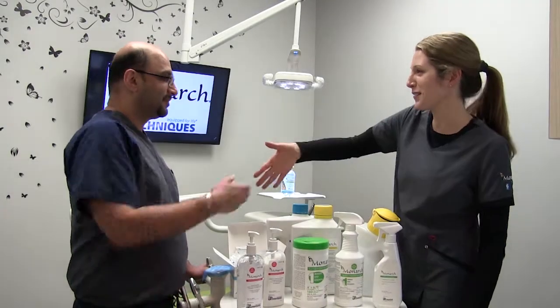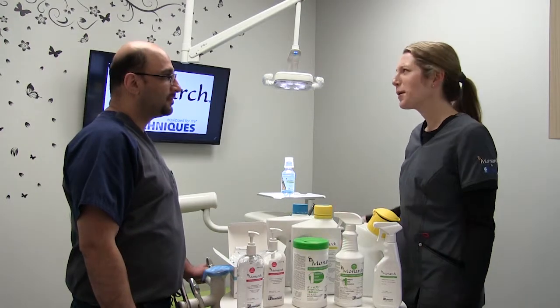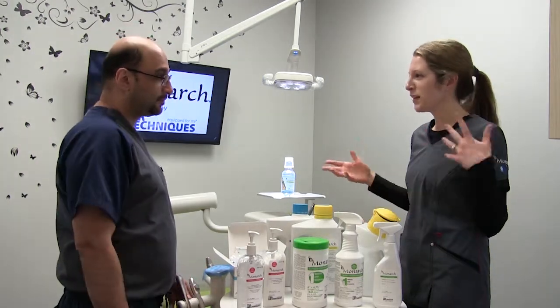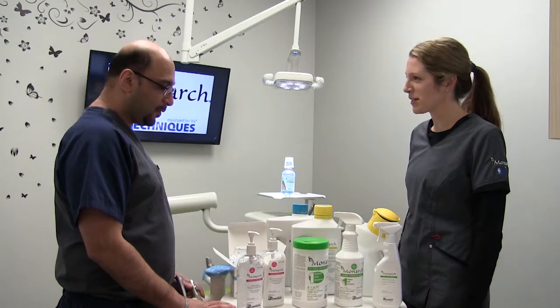Hi Dr. Rasek. I'm Carly Fish with Air Techniques Monarch. Thank you so much for having me in. Beautiful practice. I'm here to go over the Monarch line, explain the features and benefits of the products that we have, and please let me know if you have any questions.